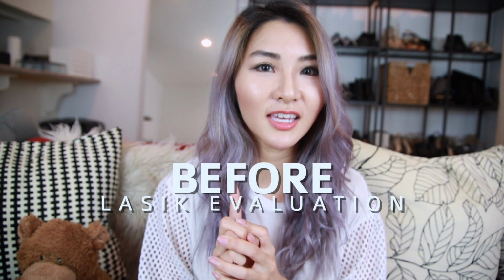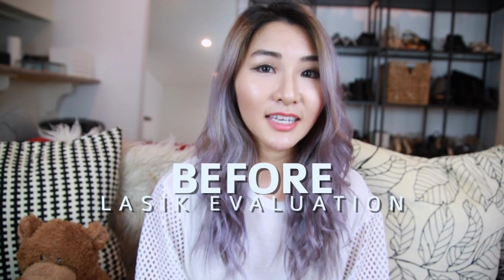So the first thing is you have to go in for a LASIK evaluation, and prior to your LASIK evaluation, you have to not wear your soft contact lenses for about 10 days. This is what it was for my doctor. I think every place is different. For hard lenses, it was about a month.